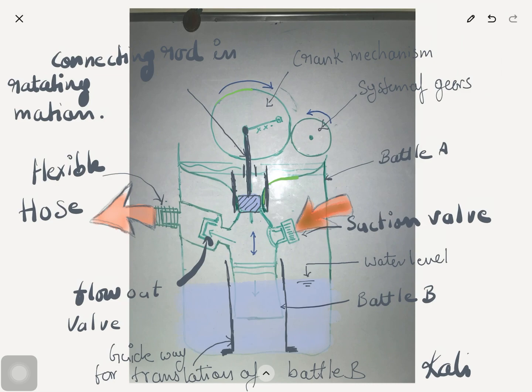In my previous video, I discussed my design. This is the design which you see right now, which is to be made into a ventilator. Although I have not proceeded with the construction of my own design, I have heard that someone is working on this design, so that is great. Since I am alone, I am not able to make it, and there are a lot of restrictions.